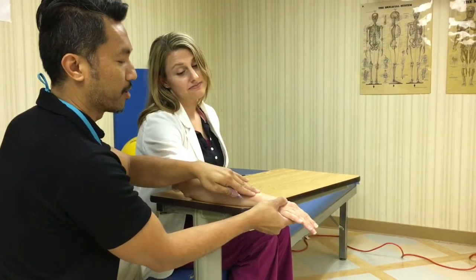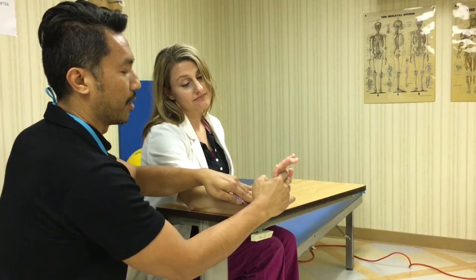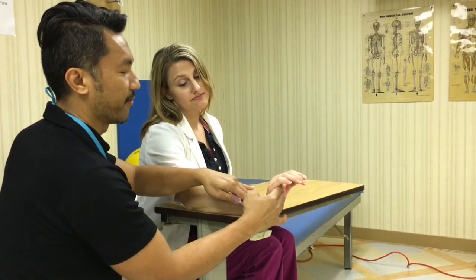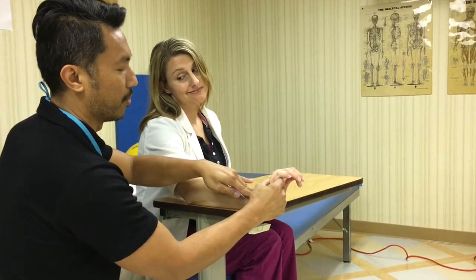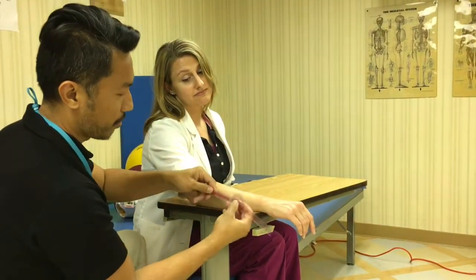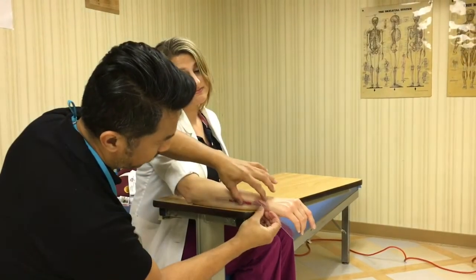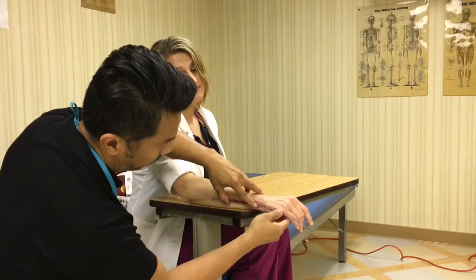So the wrist goes like this from this position, and you extend the wrist up like that, and the fingers just relaxed, there you go. Now that we determined that it's gonna go this far, I can put the goniometer in the proper position. Non-moving arm on the shaft of the ulna, the axis on the triquetrum, and the moving arm on the fifth metacarpal.